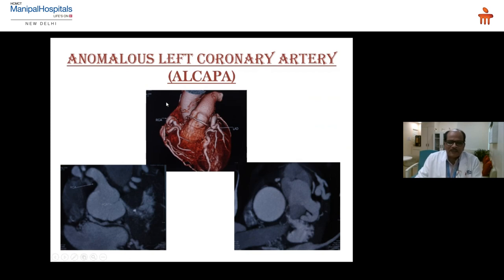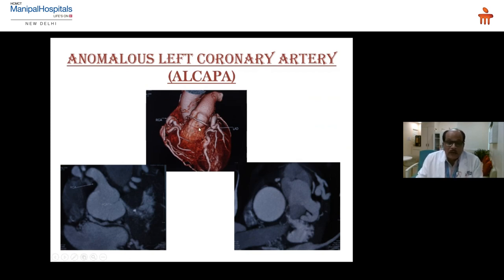A very interesting case: a 48-year-old woman presented with dyspnea only. Catheterization was attempted and they could not cannulate the left coronary artery, so CT was done. We can see a very prominent right coronary artery — the RCA is very large. The left main is not visualized from the aorta. On the next phase, the LMA is seen originating from the pulmonary artery — this is ALCAPA: anomalous left coronary artery arising from the pulmonary artery.